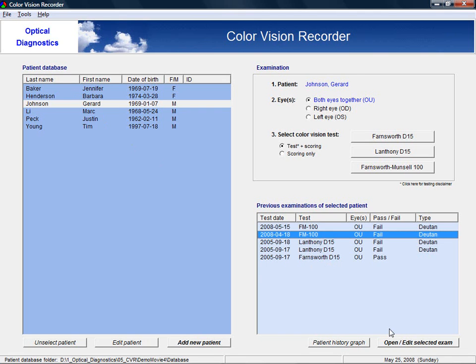To perform or score a new color vision examination, first verify if the correct patient is selected. Next, select the eye or eyes to be tested.